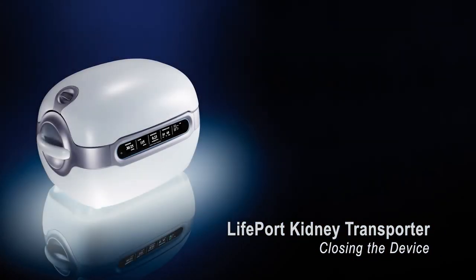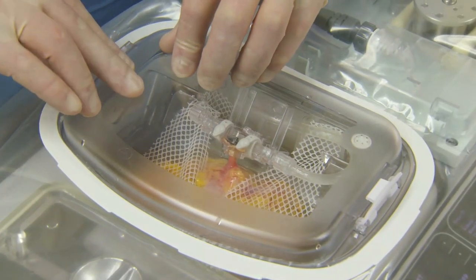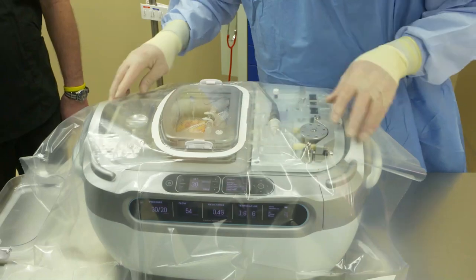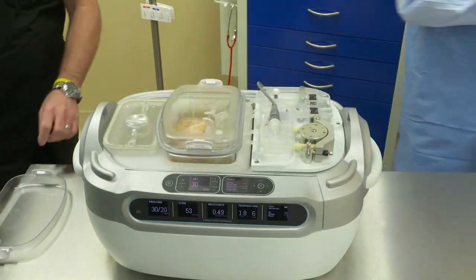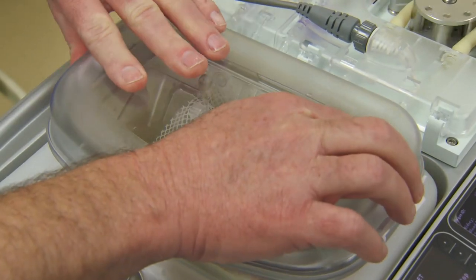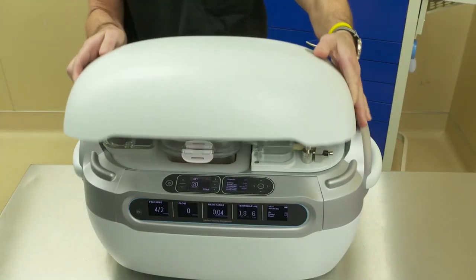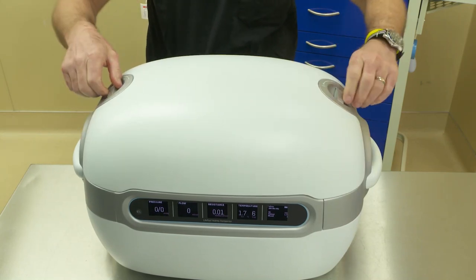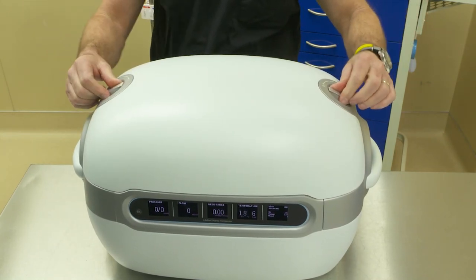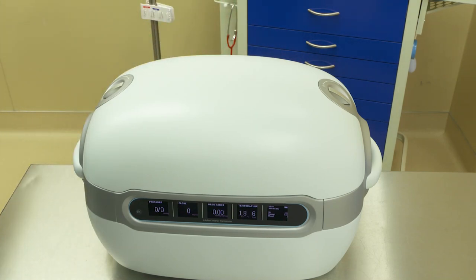Closing the Lifeport Kidney Transporter. The sterile person can then place the inner sterile lid back onto the Lifeport unit. Remove the drape. The non-sterile person will then secure the outer lid to the perfusion circuit and place the outer lid of the Lifeport Kidney Transporter on. Using the two silver handles on the ends, lock the unit down. It is important to keep the outer lid on at this point to preserve the longevity of the ice.